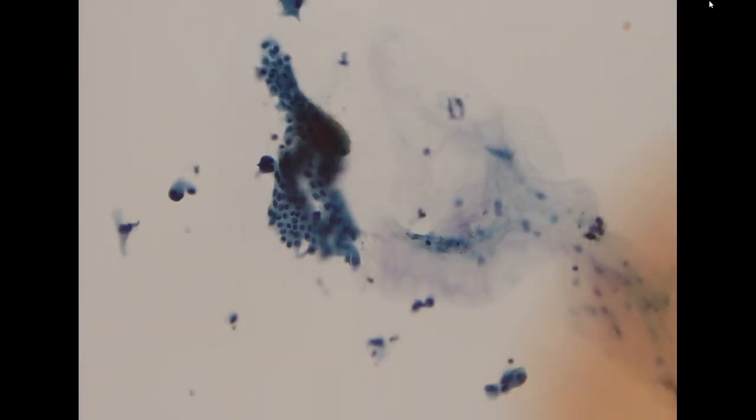So in this scenario, this can represent an IPMN with an associated invasive adenocarcinoma component. Okay, so I would say these well-differentiated cell clusters are really not normal because of the mucinous differentiation, particularly the mucin seems to have orangeophilic staining, which corresponds to more of a gastric type of mucin.